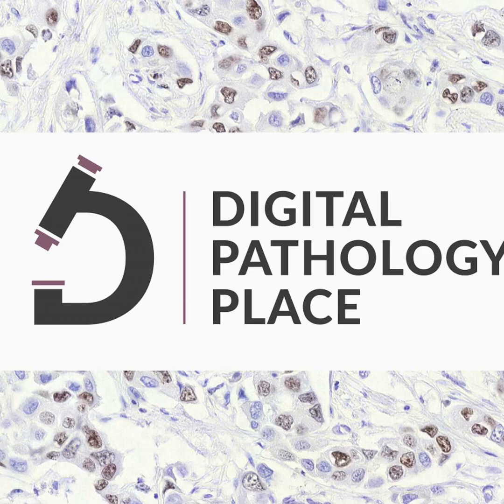Instead of aggregating everything, you have this model that goes to all these data sources. So let's say we have 5 institutions. It's going to go to institution 1, learn something there, institution 2, institution 3, institution 4. It's not even like one centralized model that goes there, like instances. The technicalities of this would need to be explained by a computer vision specialist. But basically, you don't have the aggregation. You have the model going and learning from different things. These are called nodes. It learns from all these images and is wiser, quote unquote, than it would be if it would only learn on data from one institution.